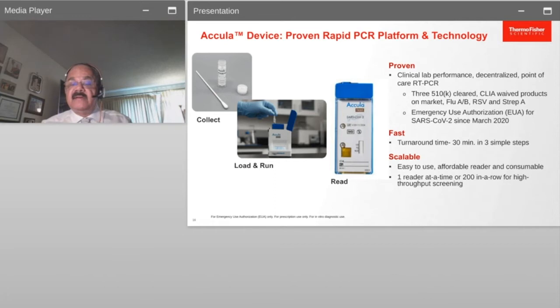The reader is a lateral flow unit, and so you have some readout in terms of certain lines on the lateral flow instrument that correspond to the control, and a positive line for indicating presence of the virus. This will considerably improve the turnaround time and speed things up.